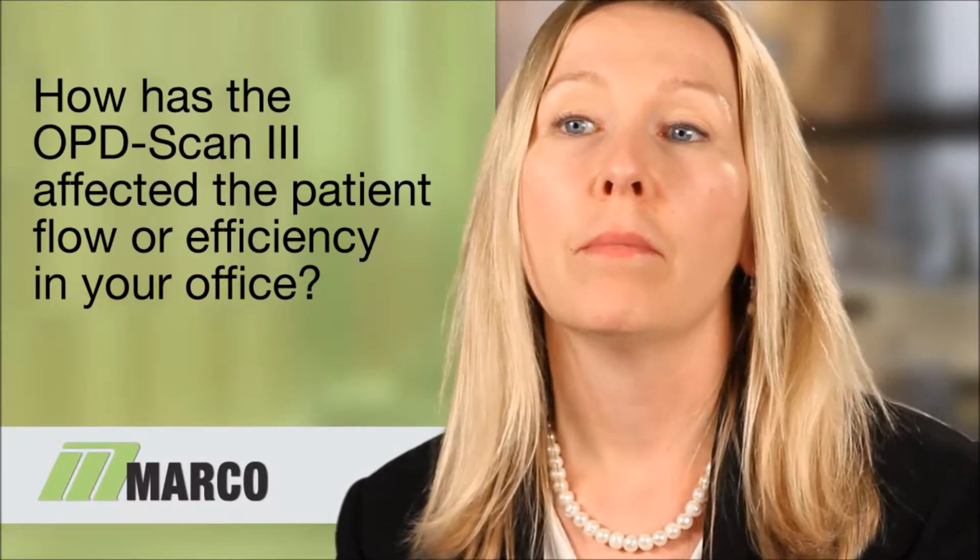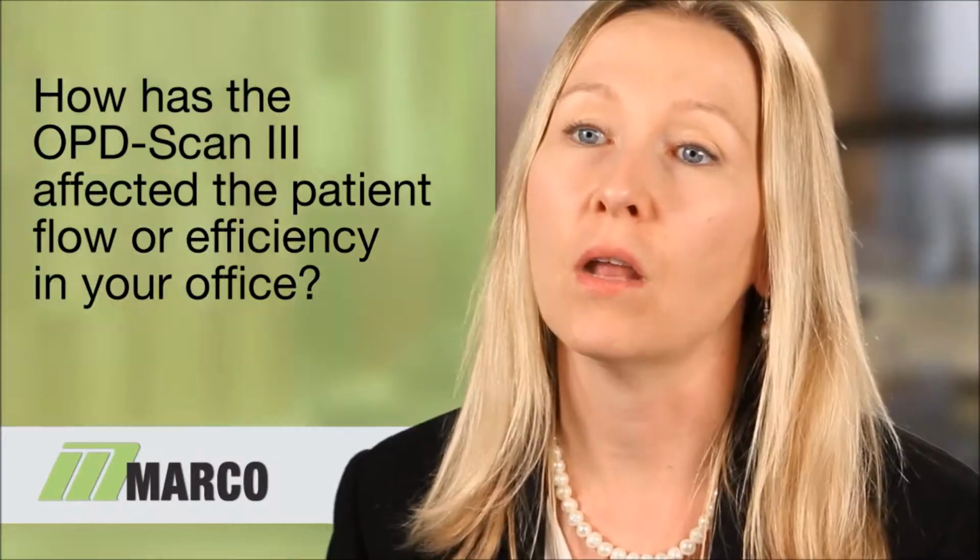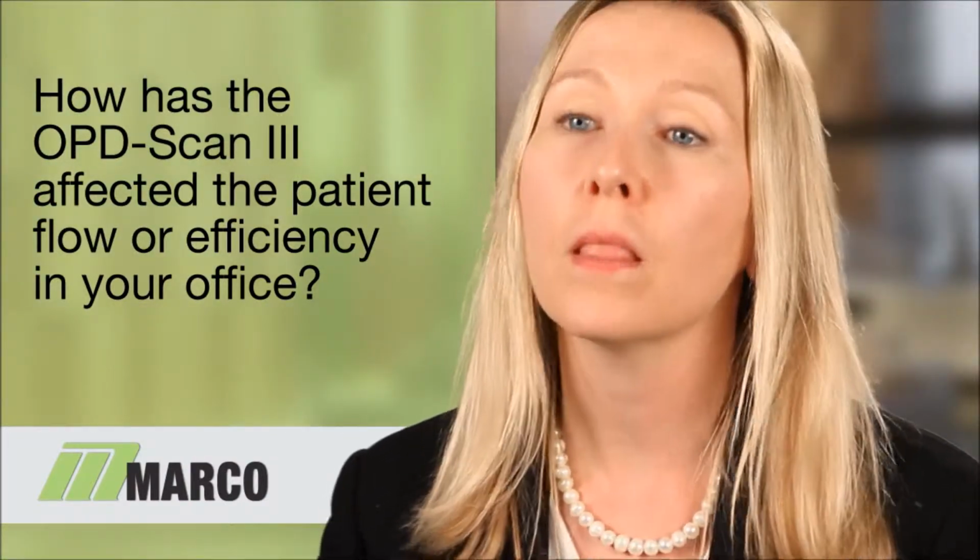OPD-3 has been great because with a click of a button you can gather so much information in patients getting ready for cataract surgery. So the OPD-3 makes our flow much more efficient. If you were to take a patient who's having cataract surgery and getting their measurements done and take him through a machine that does topography and then does aberrations and that then measures the pupil size, the patient would be getting at least 3 or 4 scans, which would take quite a few minutes, possibly 15 to 20 minutes, versus a quick scan, which takes literally seconds to perform.